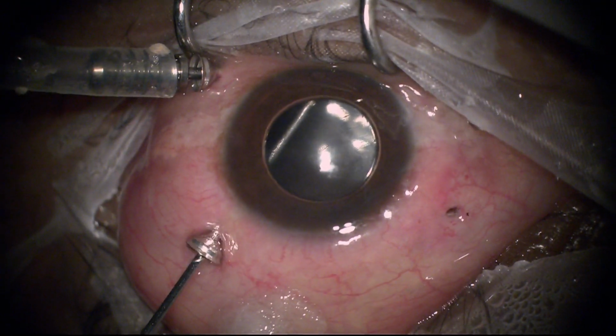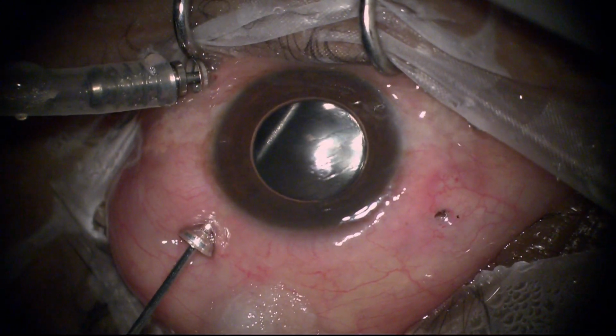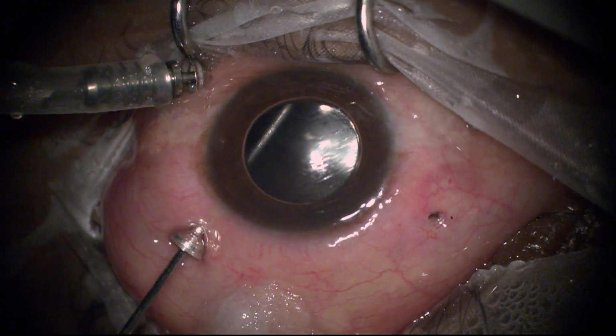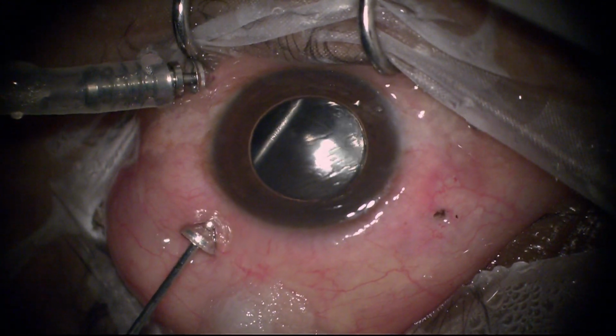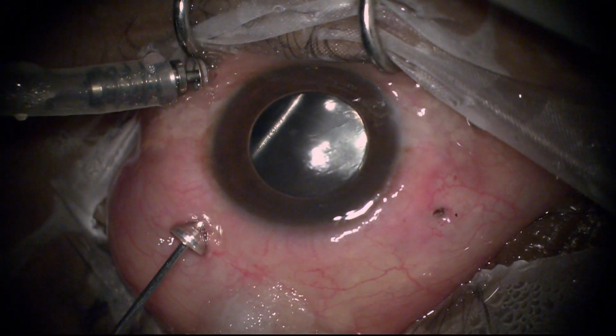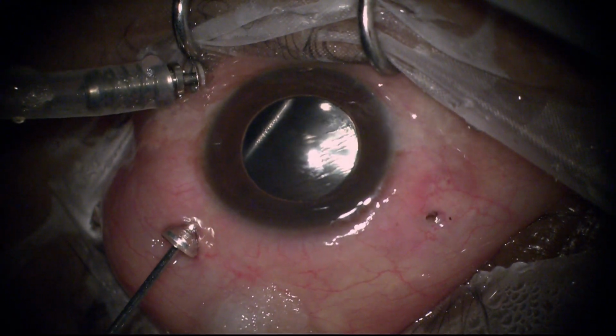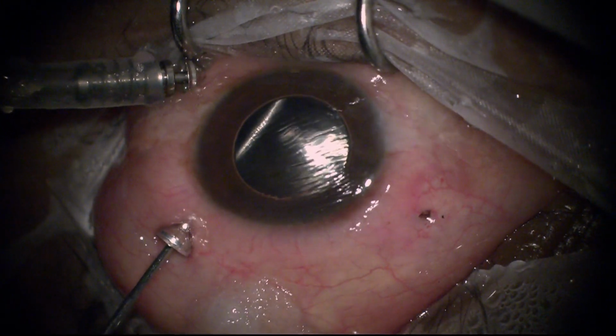It is important to ensure that the whole cavity is dry so that there is no compromise in the silicone oil filling. So the last portion of the fluid is drained at the disc, and because this patient is aphakic, there is no capsule, so it's important and mandatory to do an inferior iridectomy. This will ensure that there is no interruption in the circulation of aqueous humor from the posterior chamber into the anterior chamber, because usually the pupil will get blocked by the silicone oil bubble.